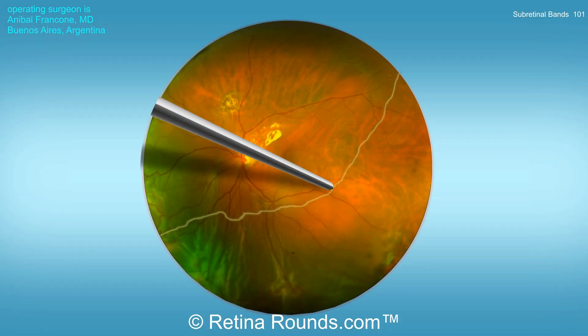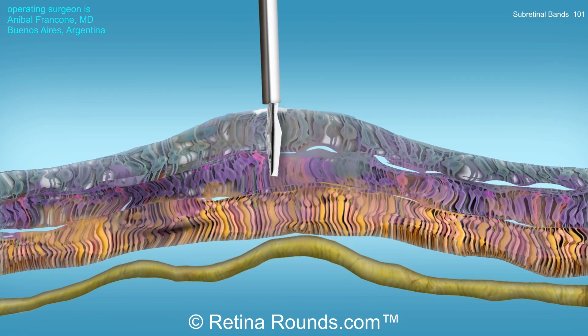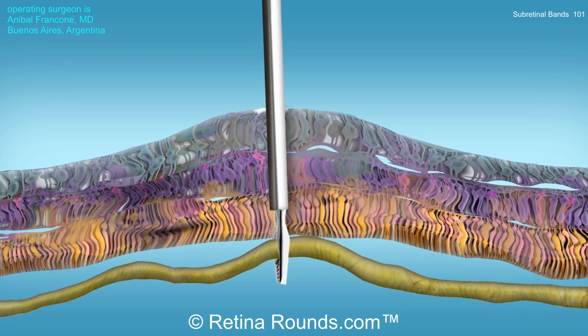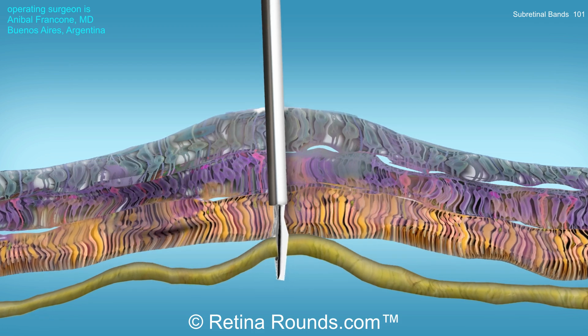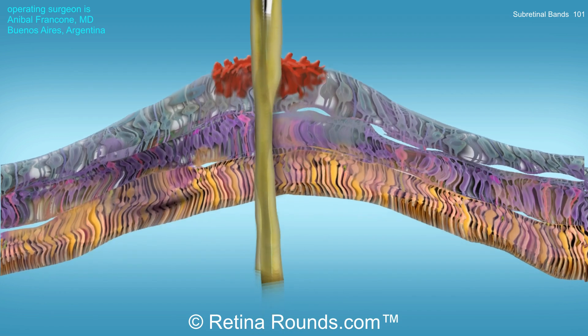Let's start by showing an animation of a traditional approach for subretinal band removal. First, diathermy is used to create a retinotomy overlying the subretinal band. Then forceps — typically max grip forceps — are used to grasp that subretinal band and pull or extract it out through the retinotomy.